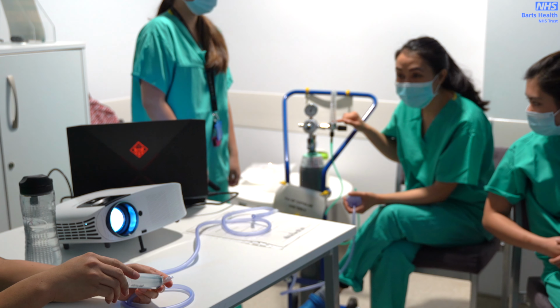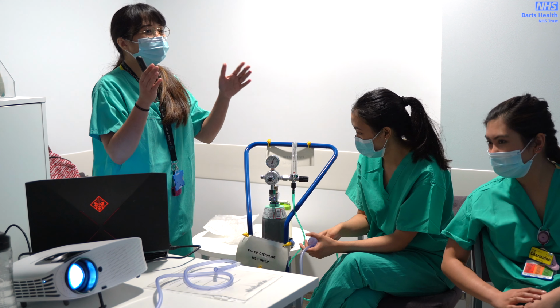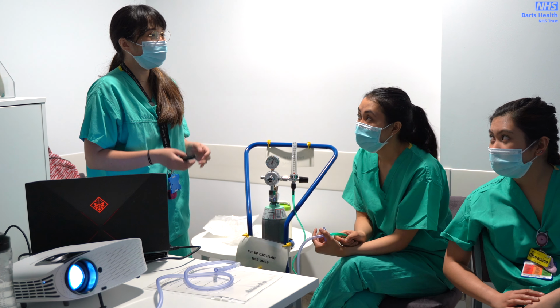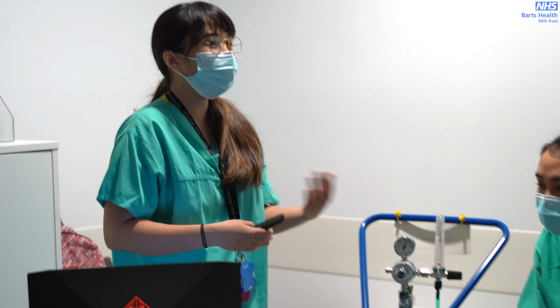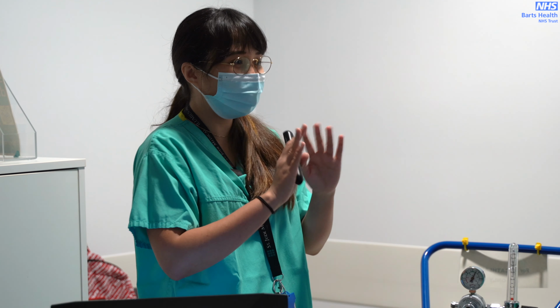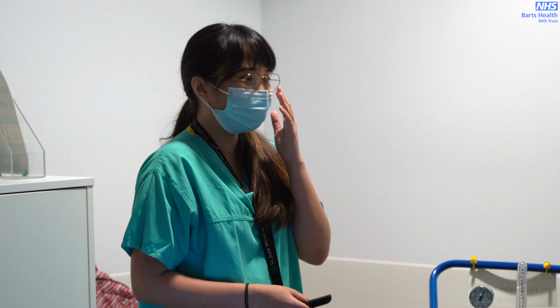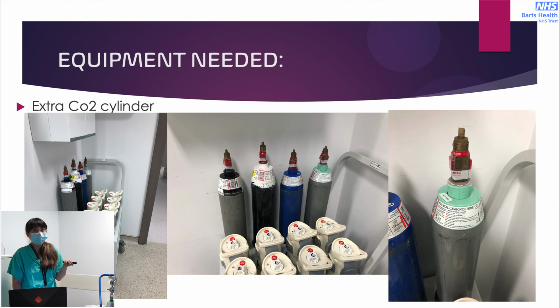But it won't affect the contraction of the heart. It's like tamponade, but your patient won't arrest, because it's CO2. Extra CO2 cylinders are kept behind lab 1, just for your information.